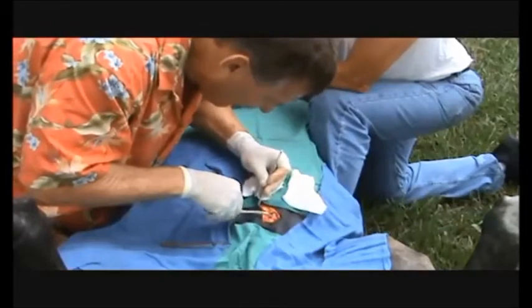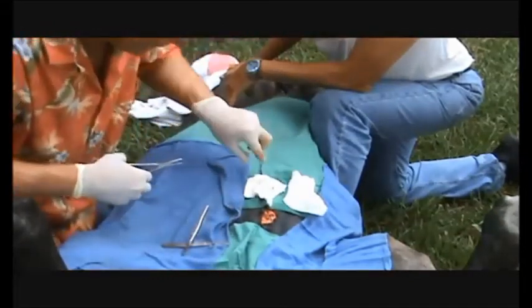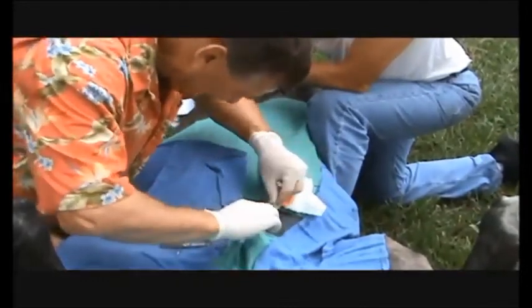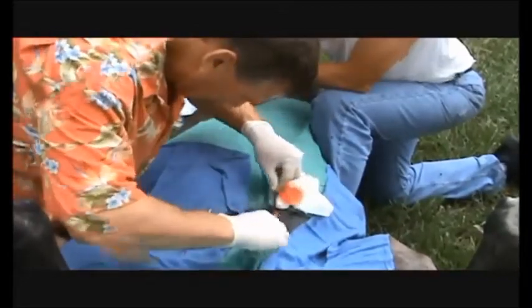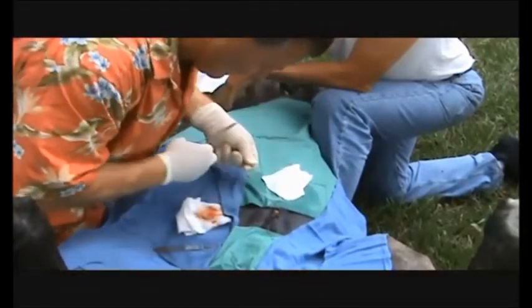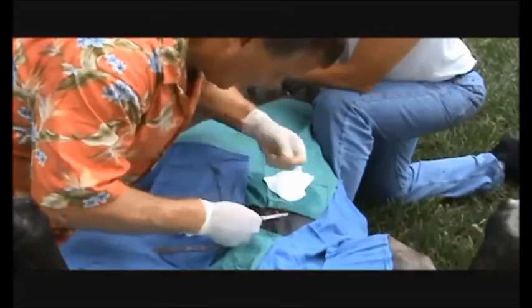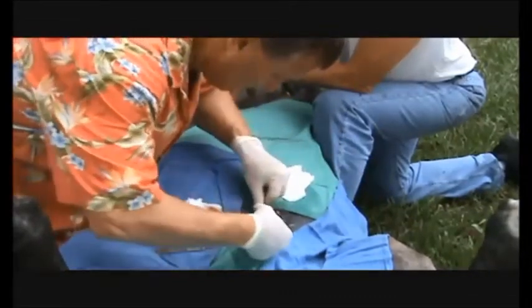He is now doing a simple continuous just to close the wound, just as you would any other. You could do a subcuticular here. He's going to do a simple continuous and then a skin. For a baby like this, if you're doing a skin, I would do absorbable suture, because you really would be in an awkward position to try to remove your suture, and that would be fine. You could even get by without doing a skin suture at all, just do a subcutaneous, as I said, or a subcuticular.